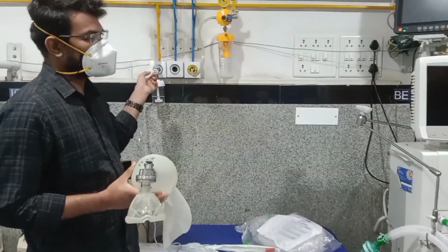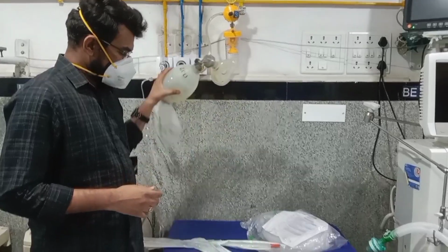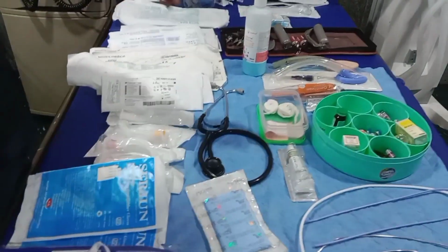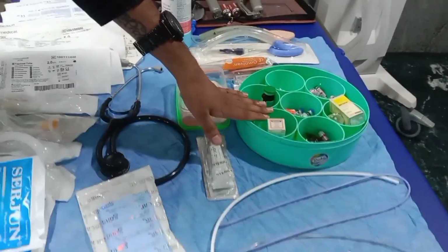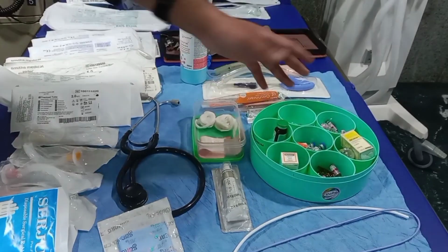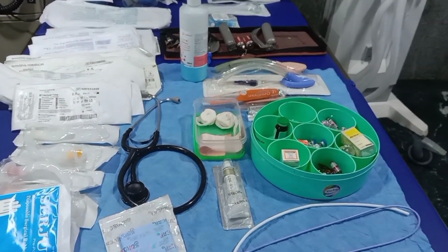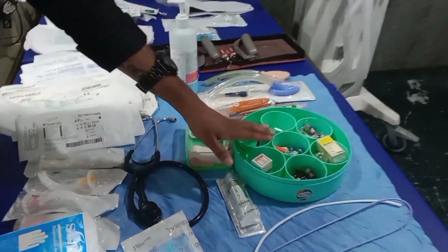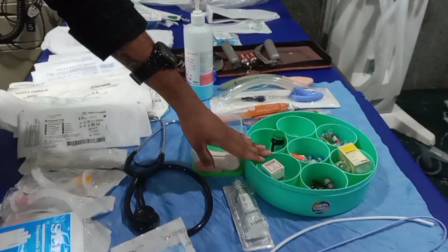Ambu we should see whether it is in working condition. It should be connected to the oxygen. So after checking this, we will sedate the patient by giving the medication. Sedation can be given with midazolam or propofol, whatever the indication is for the intubation.